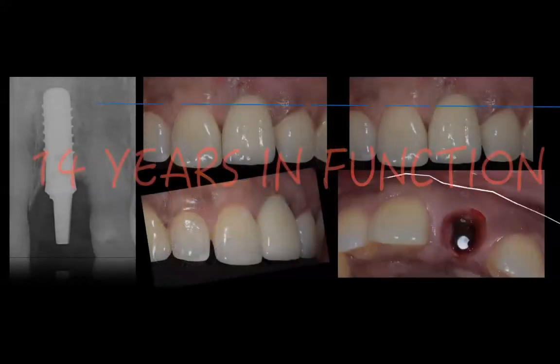I want to show you a case that I have done 14 years ago. Patient came in. You're looking at a Straumann implant, tissue level, 4.8 by 12, strong tooth, strong implant. I take out the tooth, I put an implant in there, and I immediately load the patient. Now the photograph you're looking at is 14 years later.